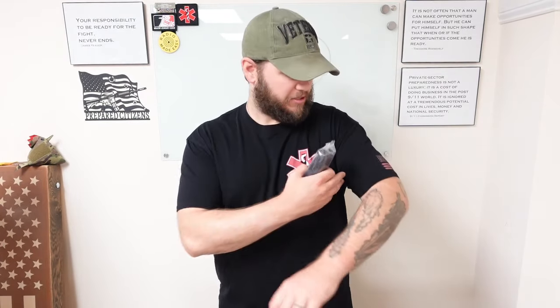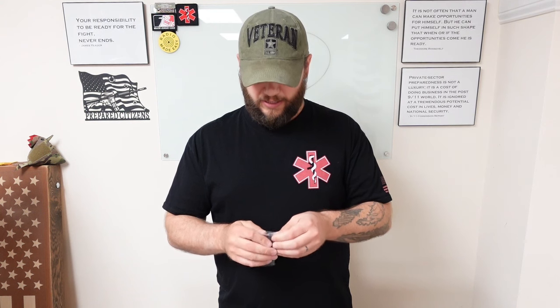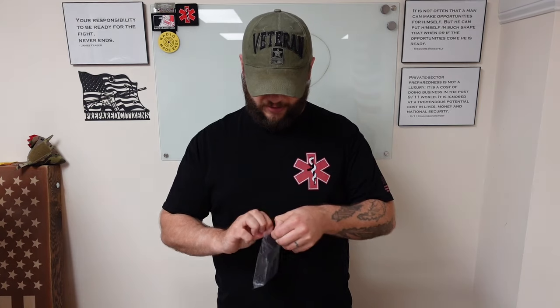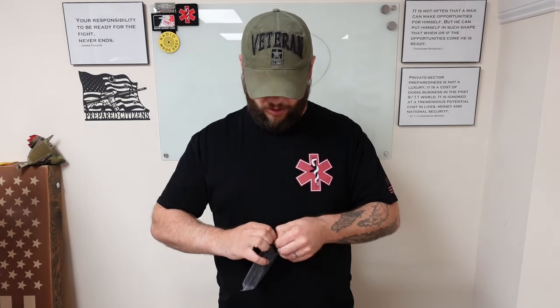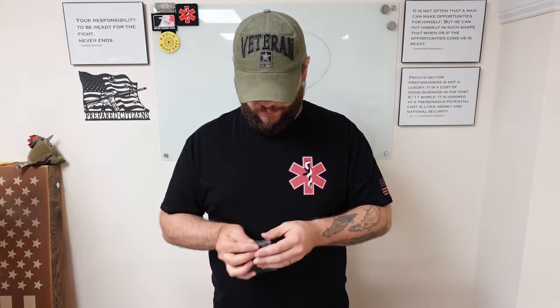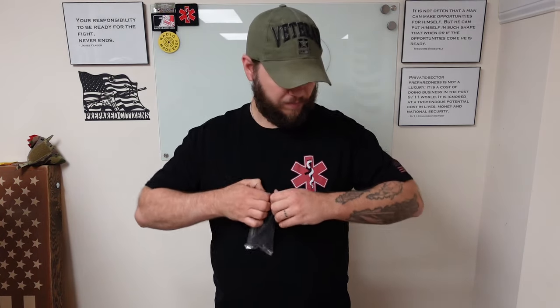We're going to open this one together and I'm just going to do the normal good old standard — throw it on my arm and just see what we get. I'm really excited to try these. I'm going to be testing them and carrying them every day. Probably should have gotten a knife or something. It's good packaging.